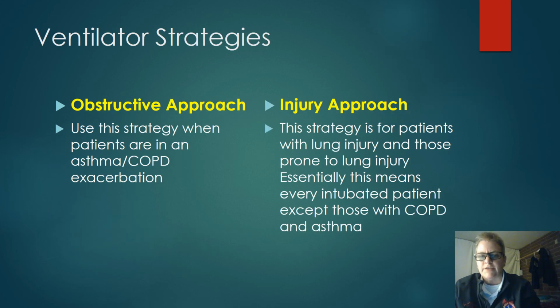Next on our objectives is what we call ventilator strategies. How do we set up these ventilators? And I'm going to talk about 2 approaches. The obstructive approach, those are strategies that we use on our obstructed patients only. Asthma, COPD exacerbations. That's it. Obstructive approach, asthma, COPD. Our injury approach basically is everybody else.